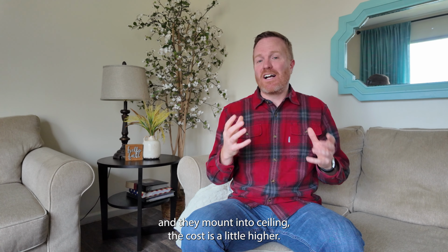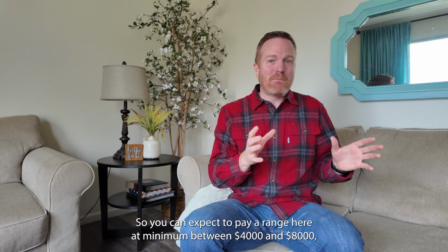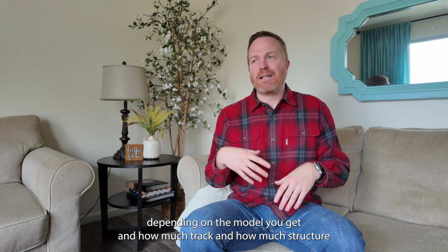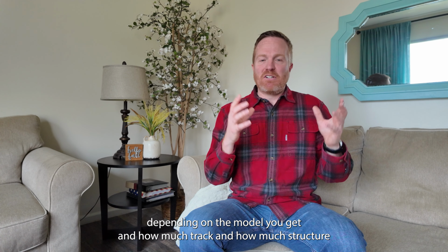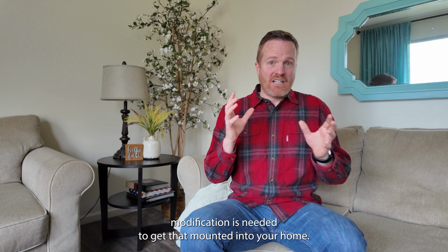Now, because they're so versatile though, and because they're out of the way and they mount into the ceiling, the cost is a little higher. So you can expect to pay a range here at minimum between $4,000 and $8,000 depending on the model you get and how much track and how much structure modification is needed to get that mounted into your home.